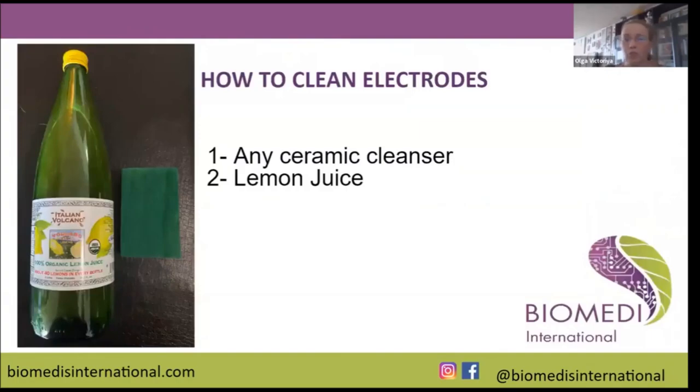After you finish your test, it is very important to clean the device, because you're going to see a lot of black on that metal and that brass, and that is toxins which came out from the person. So you cannot just use it for somebody else. Me personally, I prefer to use lemon juice. I buy it at Costco in bulk. It's very cheap. You put a little bit on the electrodes, and I use this surface to scrub it and wash it with water, and they're going to be sparkling clean with all the toxins removed.